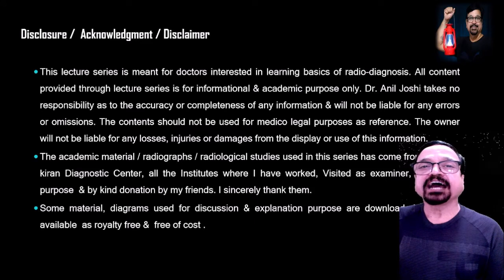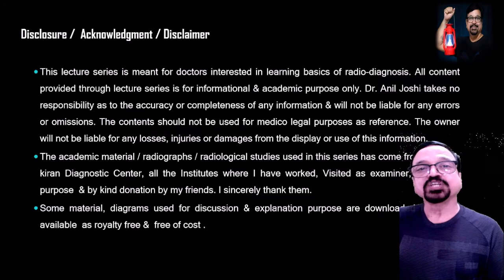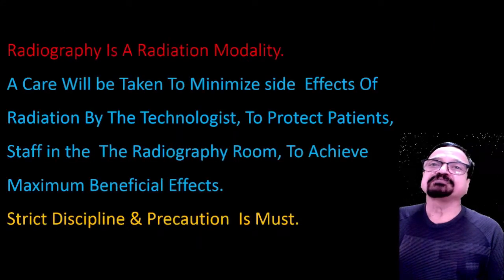So a brief idea about the anatomy as well as radiographic lines and views is required, since we are converting three-dimensional anatomical structures into a single plane. So it is important to understand the anatomical structure in depth, and also how the radiographs are taken.